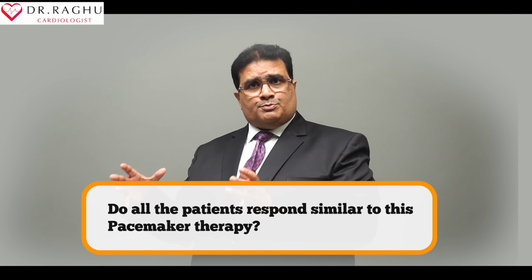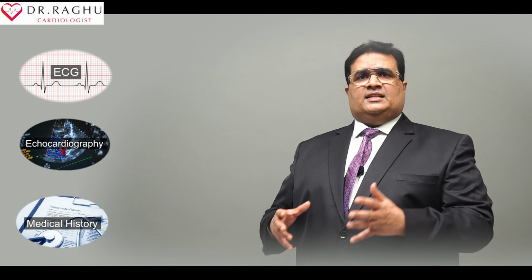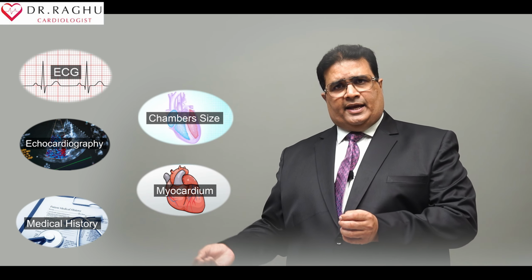That means the ejection fraction will improve from 30 to 40% or even 42%. That is the improvement we can expect by using cardiac resynchronization therapy. Do all patients respond similarly to this pacemaker therapy? We have to determine based upon the ECG criteria, the echocardiography criteria, past patient medical illness, the chamber size, and the amount of scarring of the myocardium on cardiac MRI.